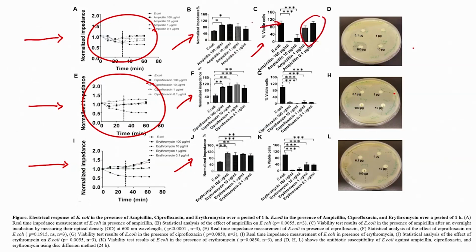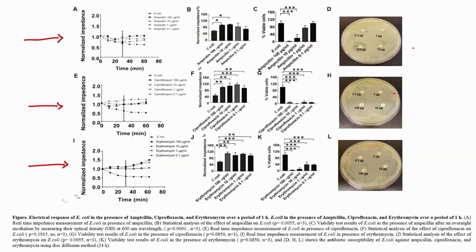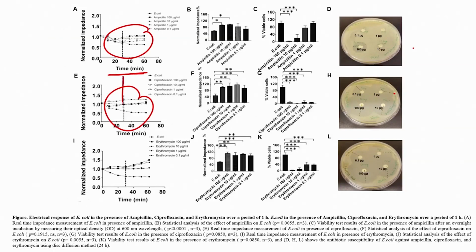So, what we see is that from this study we can understand the minimum concentration of antibiotic that we should prescribe to a patient. Also, using this technique we can quickly correlate with the gold standard, and we can rapidly measure the change in impedance in as little as 1 hour. This is really rapid, right. In the normalized impedance versus time plot, within about 1 hour we can see the change, and this is for 30 minutes, because of the doubling time of the bacteria, right.